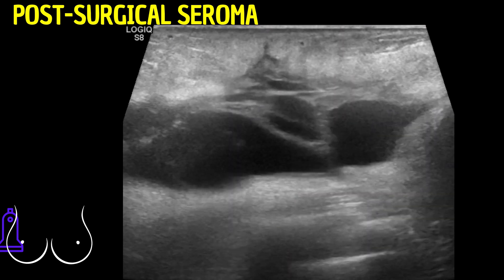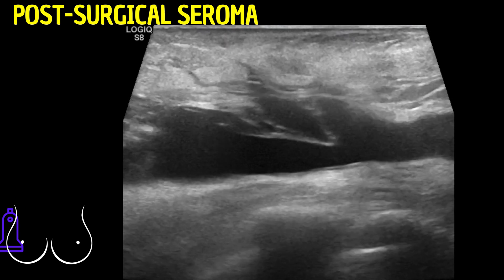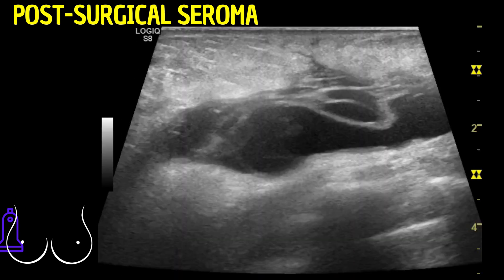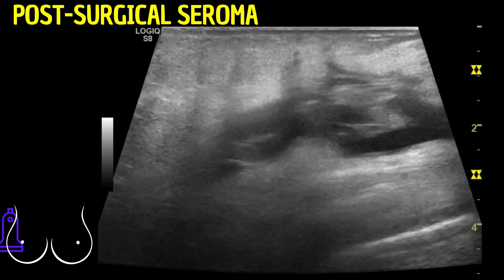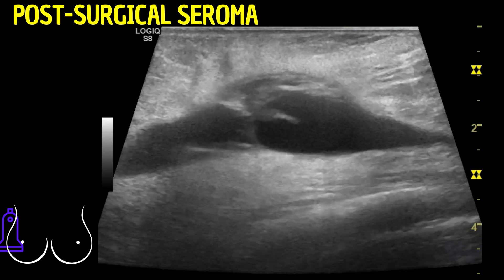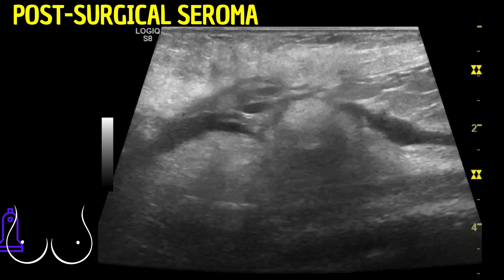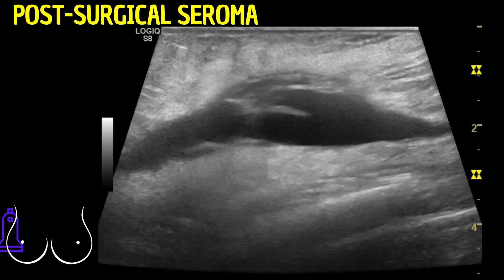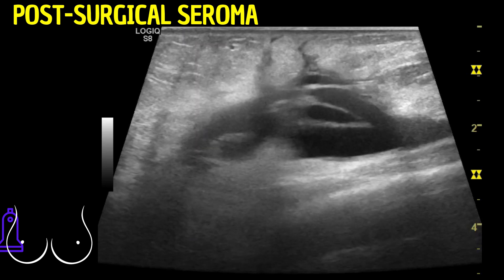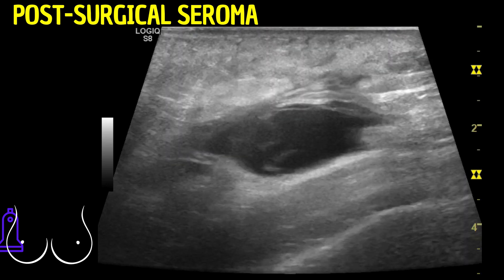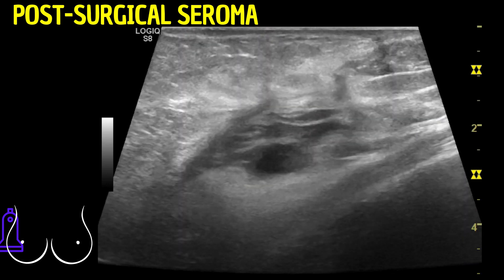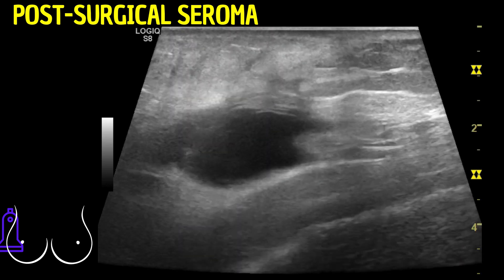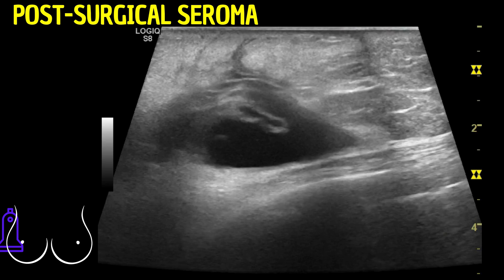Another notable feature in this moving imagery is the increase in echogenicity of the adjacent soft tissues. This variation in brightness, indicative of the tissue's response to the ultrasound waves, suggests possible inflammation or changes due to the seroma and the body's healing response.